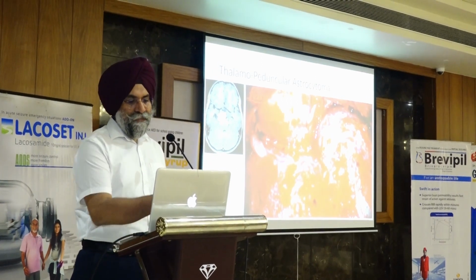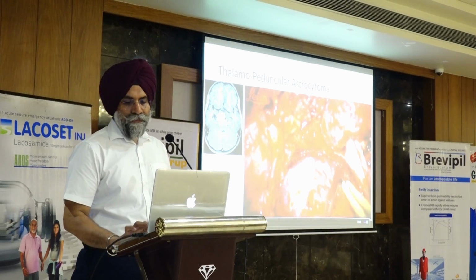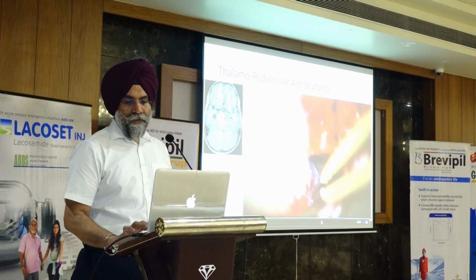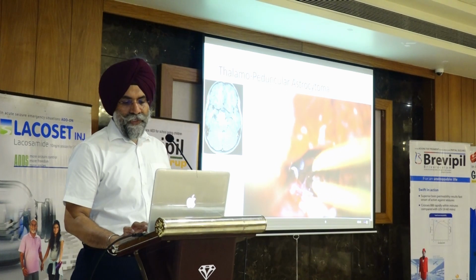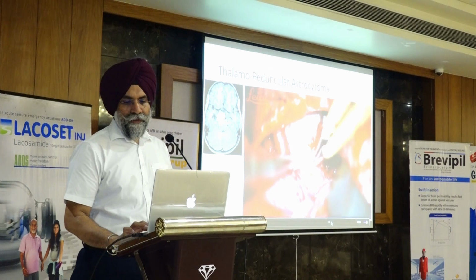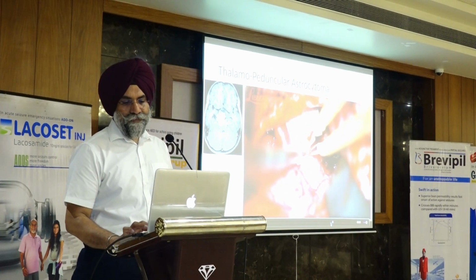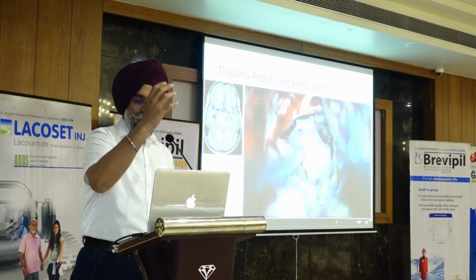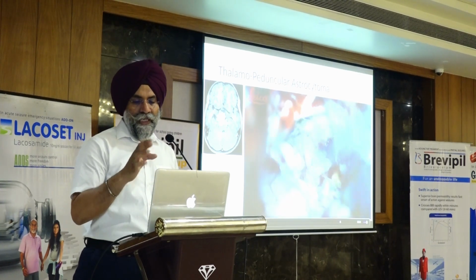So this is again the same thing, a thalamopeduncular astrocytoma, same approach and same dissection, and again the thin posterior communicating artery, which is divided and separated. So make sure that you are not compromising any of the perforators arising from the posterior communicating. You have to make sure that they are preserved.